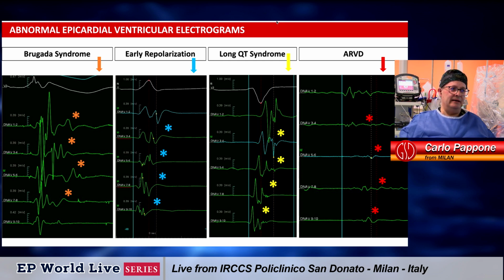We can have the prolongation of abnormal electrical activity in the Brugada and in the early repolarization, long QT, double potential and fragmentation, and in the right ventricular or biventricular dysplasia, the important reduction in the voltage. So Giuseppe, let's go to the case we are discussing today.